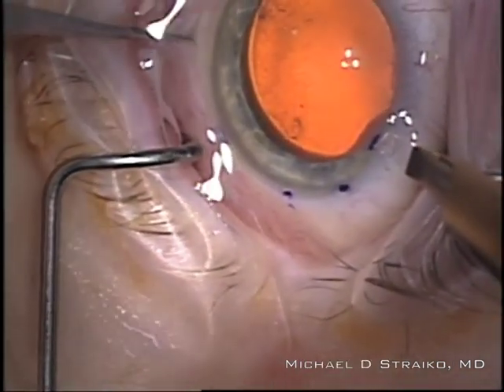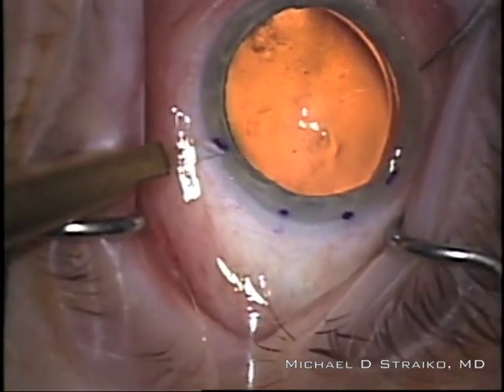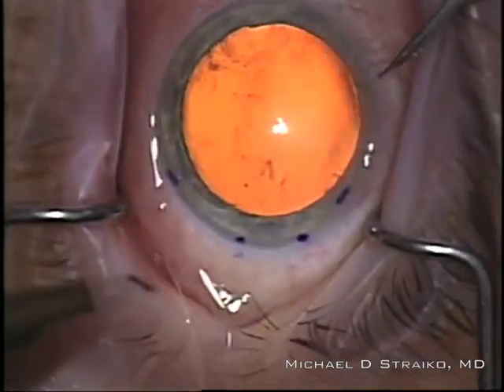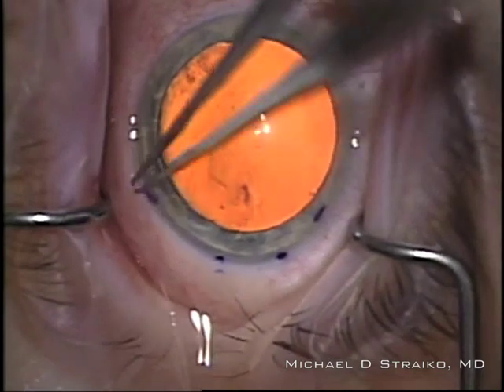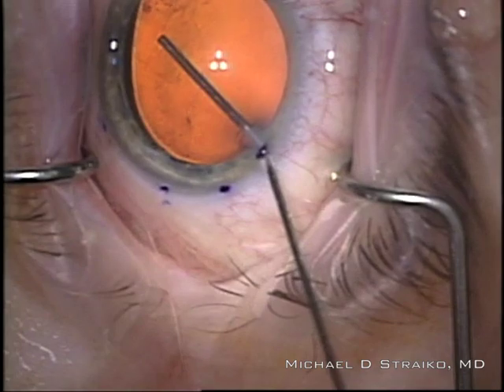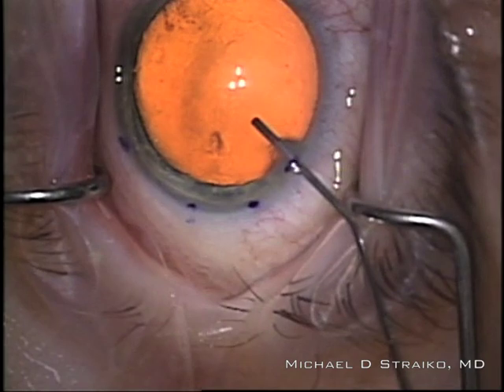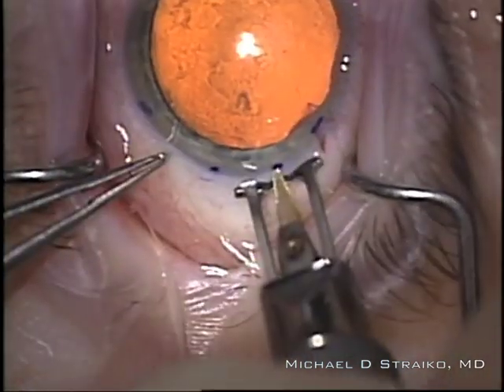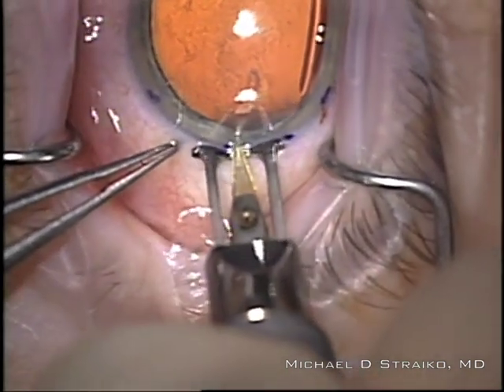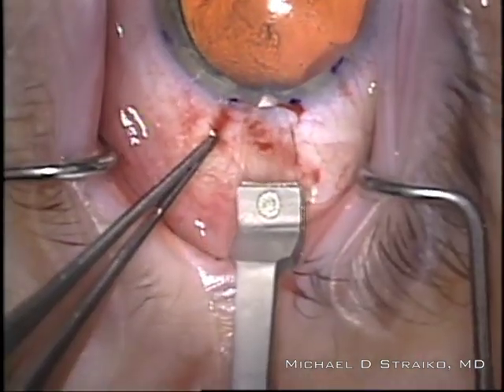You'll see I've made marks for where I'm putting my incisions, so they're easier to find later. I use one millimeter diamond blades to make my paracenteses. I make them fairly flat so that the wound architecture is square and seals well, which is what I'm showing with the forceps there. I'm injecting a cohesive viscoelastic to maintain the anterior chamber during the surgery. Now I'm using a preset diamond knife set to 300 micron depth to make a groove that'll aid in suturing the wound very nicely later.